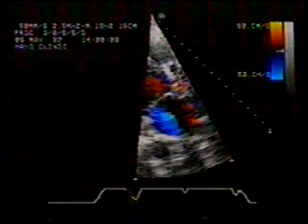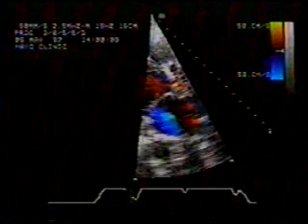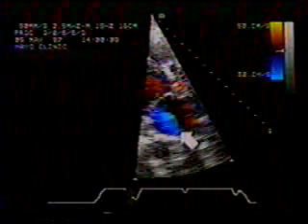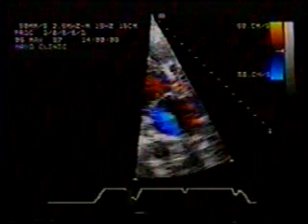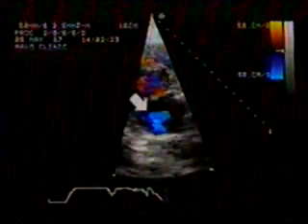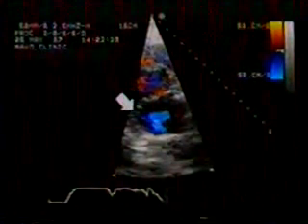This patient has papillary muscle dysfunction resulting in mitral regurgitation. This is a parasternal long axis view with the sector narrowed to focus on the mitral valve and left atrium. The mitral regurgitant jet is evident behind the closed mitral leaflets, and a mental note is made of its spatial extent within the atrium for comparison to other planes. This is the parasternal short axis view. The regurgitant jet, seen here beneath the anterior mitral leaflet, has a smaller area in this plane than in the long axis plane.